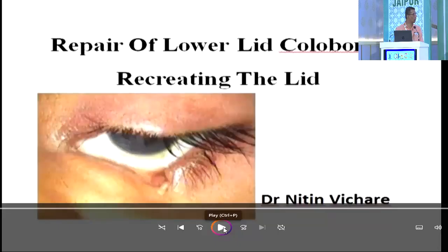Vertical mattress, coloboma repair of post-traumatic lid defect, doing a tenzel semicircular flap, which is very easy, and many specialists, even junior specialists, are afraid or hesitant to do the flaps, the basic tenzel flap. So this is a case in a young child, 18 months old, where a good surgical outcome was achieved of the coloboma repair. Thank you.